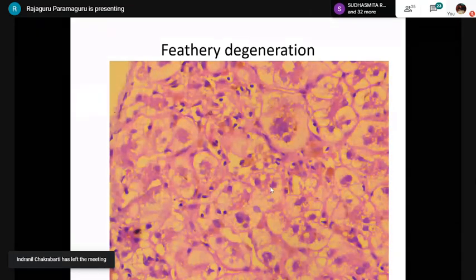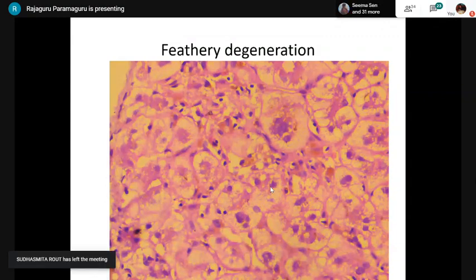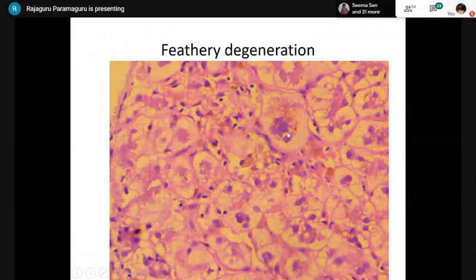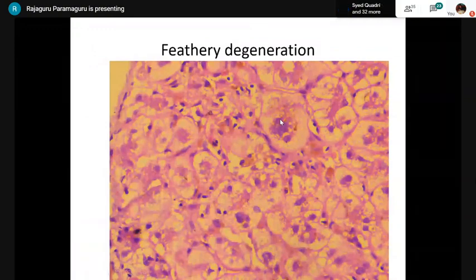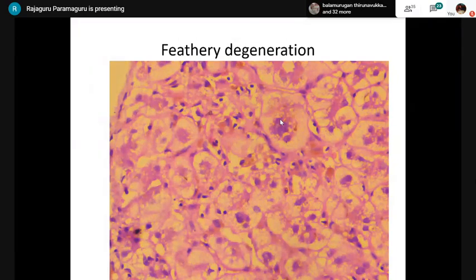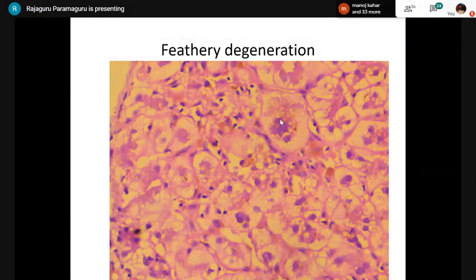Feathery degeneration occurs in cholestatic liver disease due to accumulation of bile salts within the hepatocyte. Giant cells can also be seen in cholestatic liver disease. Feathery degeneration has rarefied cytoplasm, similar in appearance to ballooning, but you will demonstrate cholestasis. All three — feathery degeneration (cholestatic liver disease), ballooning degeneration (acute hepatitis), and hepatocellular ballooning (steatohepatitis) — are distinct and must be differentiated.